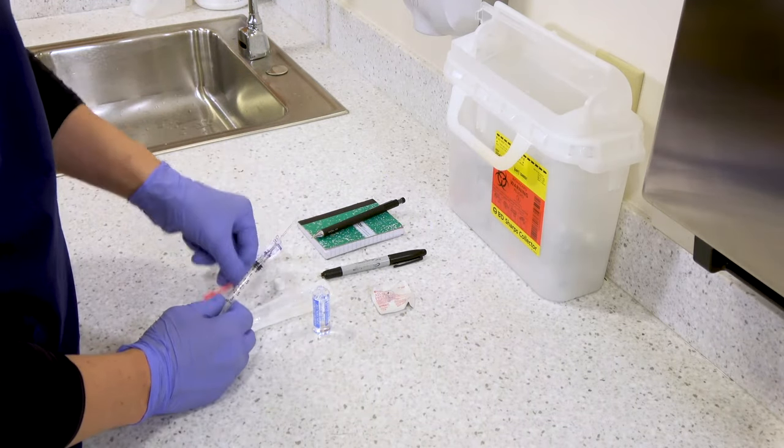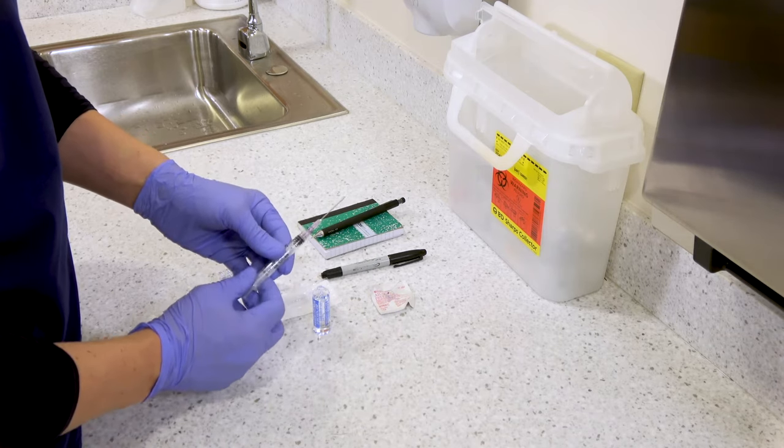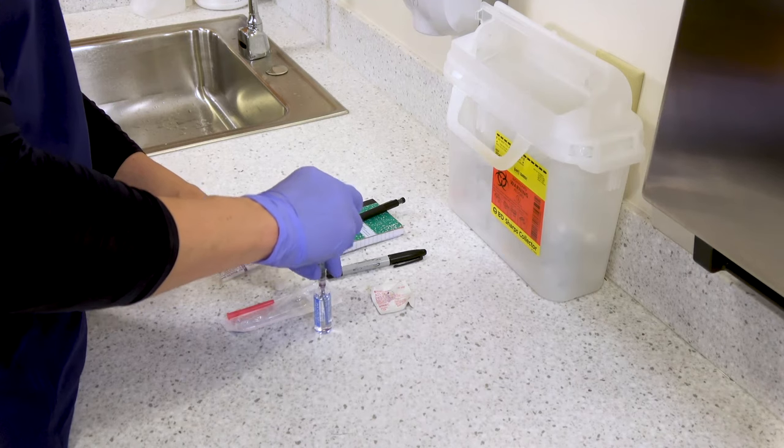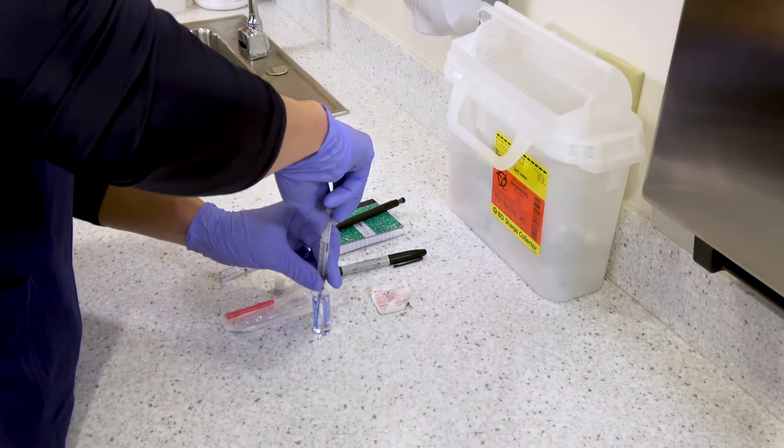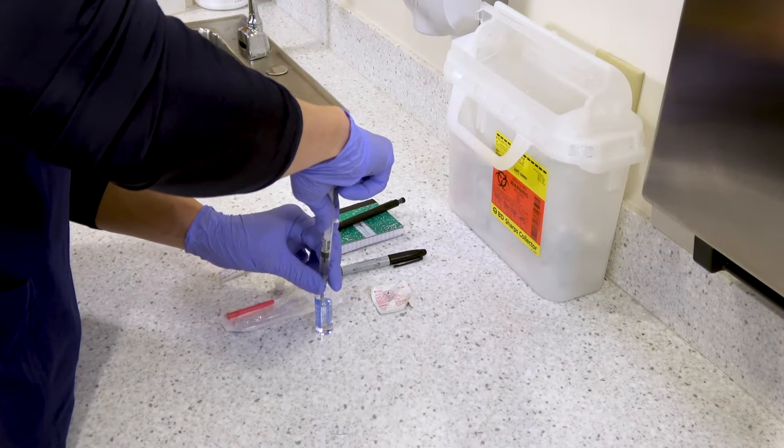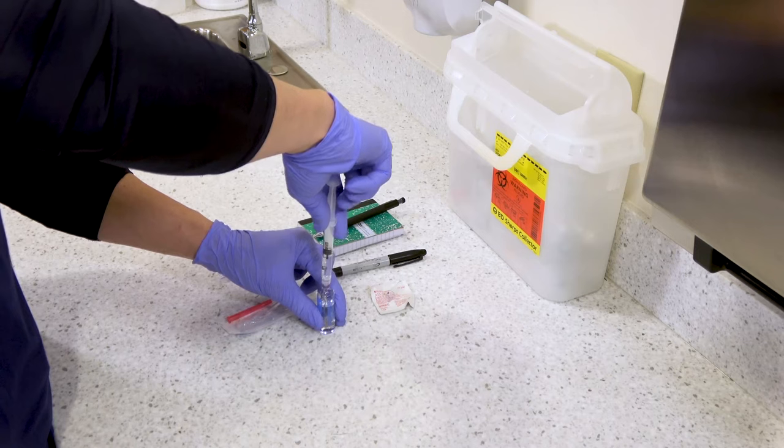Now you can grab your syringe with your filter needle, uncap it, and you're going to insert it into the ampule and withdraw the correct amount of liquid from the ampule. You may need to tilt the ampule to get the liquid if your needle's not long enough to go to the bottom.